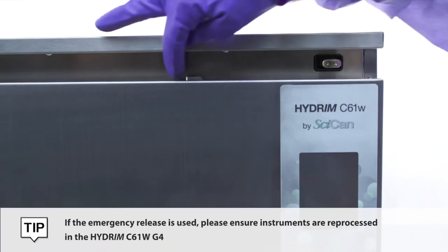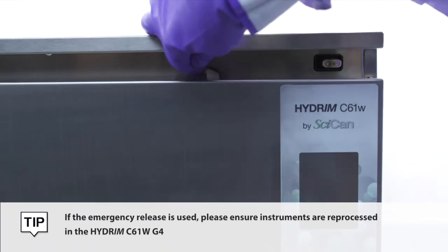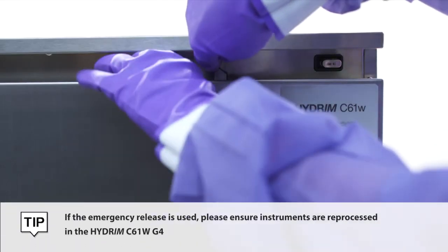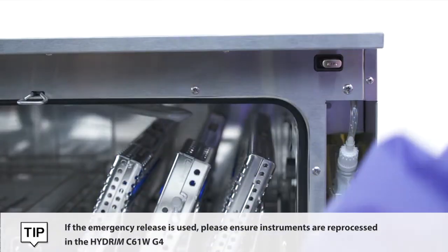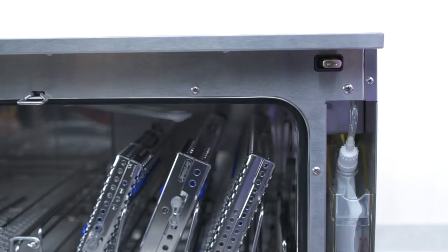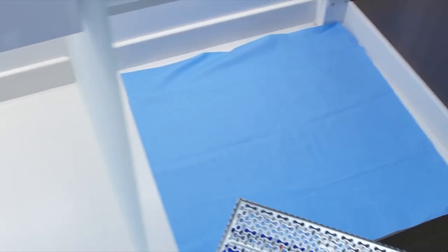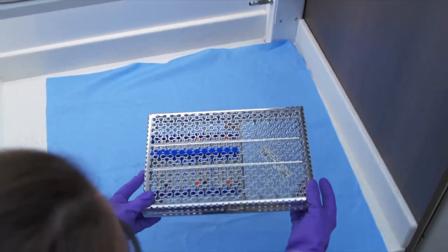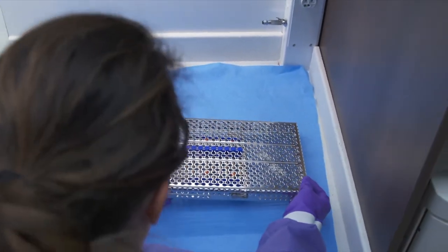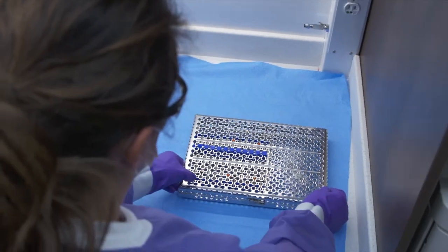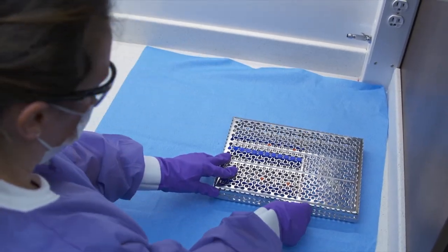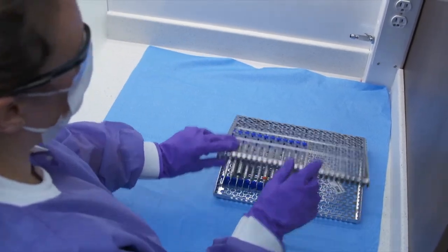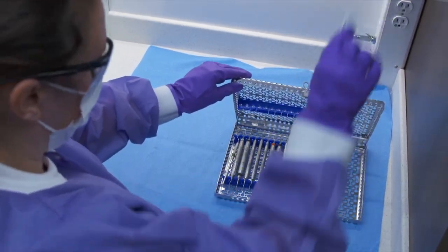In case of a power outage, there is a manual release mechanism located on the top edge of the door. The instruments are now washed successfully and ready to be pouched or wrapped for sterilization in STATUM, STATCLAVE or BRAVO.